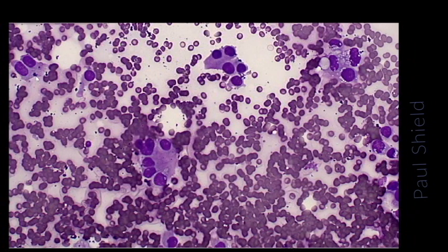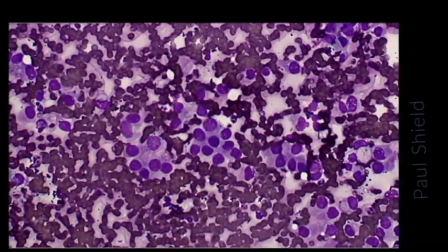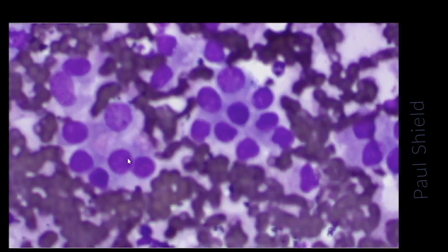This is almost an acinar type arrangement also. And this area here is showing nice glandular arrangements. So you can see in that group there, this is almost a rosette of cells with the nuclei arranged like flower petals, if you like, the cells all to a central point, which would be the lumen of the gland.